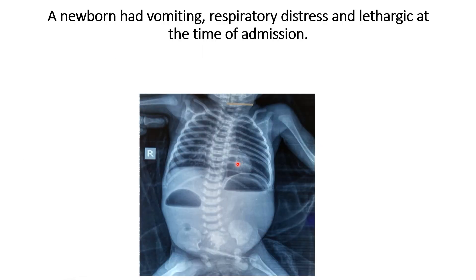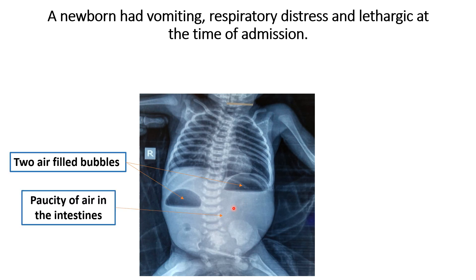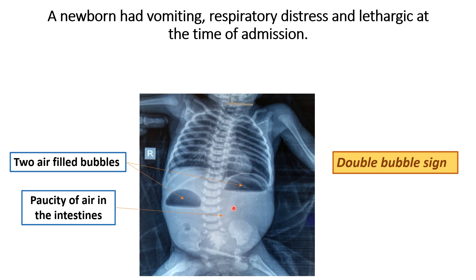This is the X-ray of a newborn admitted for vomiting, respiratory distress, and lethargy at the time of admission. In this X-ray, you can see only two air-filled bubbles are visible, and in the other part of the abdomen, there is no gas-filled distal bubble visible. This characteristic finding is labeled as the double bubble sign, and the abnormal radiological finding in this X-ray is the double bubble sign.